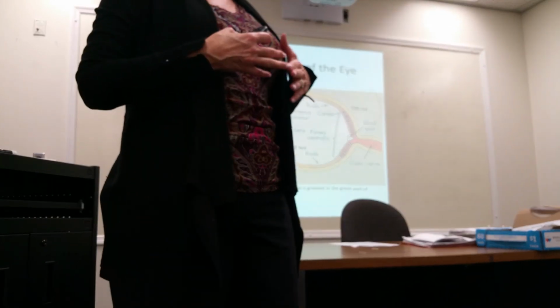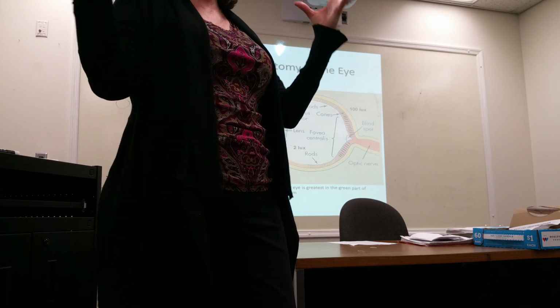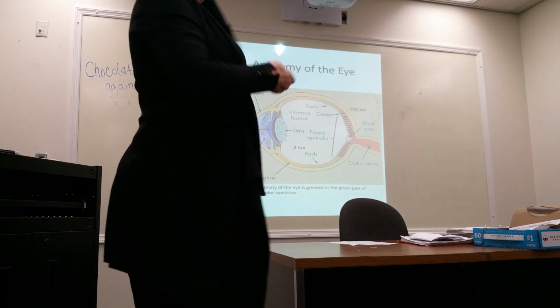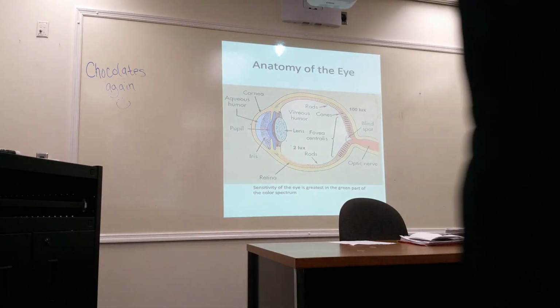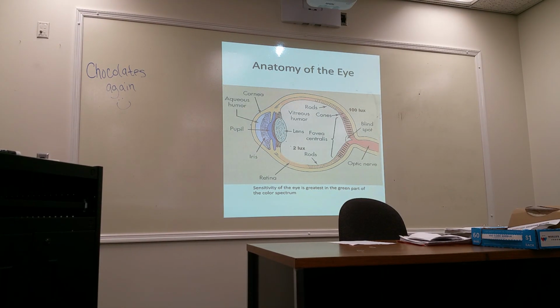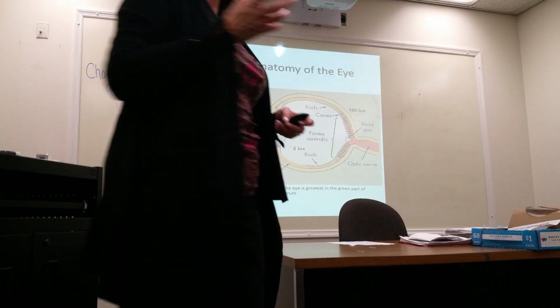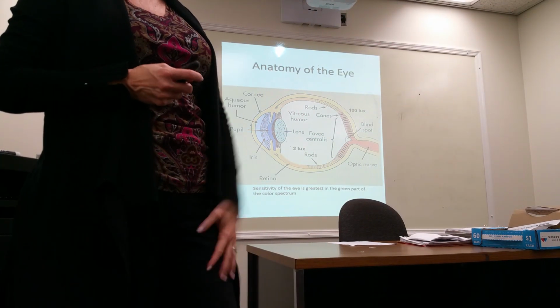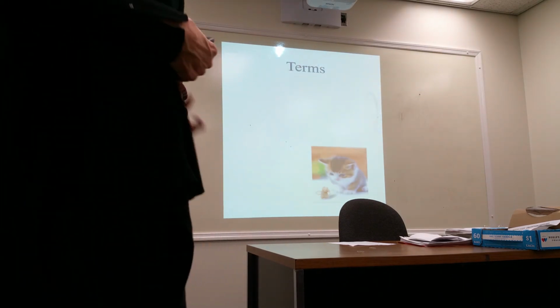Now with the image intensifier tube, it intensifies the image, and so they're able to use the cones, your daylight vision, your photopic vision, to look at it. You can now see the image. We still dim the lights a little bit, but it's not dark in there. You can see what you're doing, and cones are what's used for that. So much easier to see the image that we're looking at. Do you remember some of that?